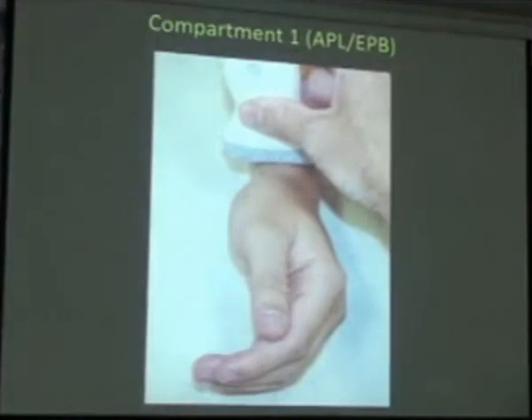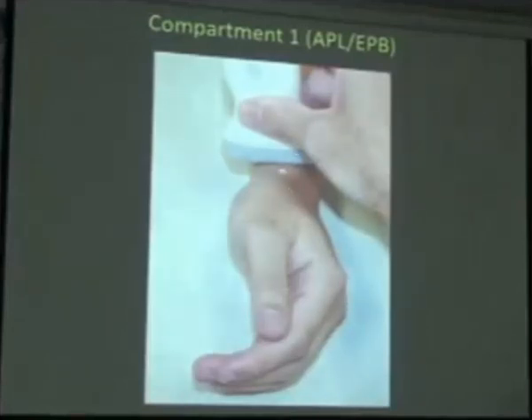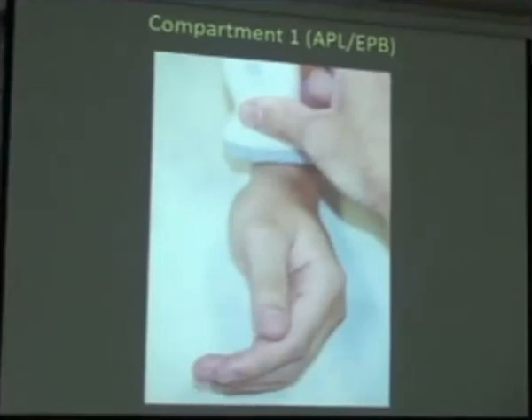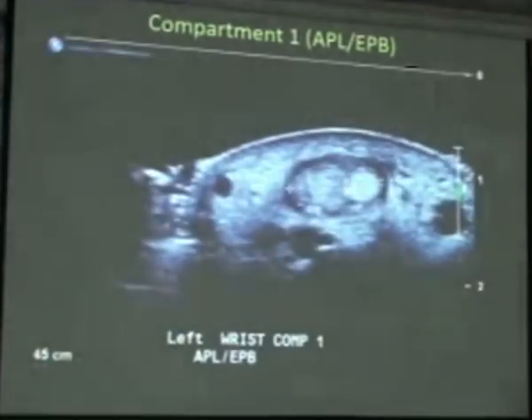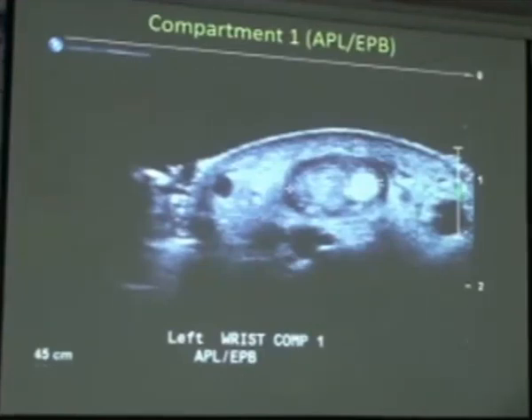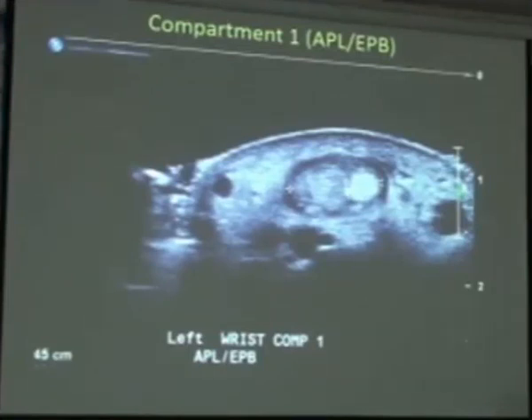The procedure to image this is quite simple. I sit the patient on a chair beside the bed with their arm resting on the bed. I do not use any standoff media — I just place the probe directly onto the wrist. The APL is the larger of the two tendons, and the EPB is right next door. It may look like a single sheath, but there's often a little separation that you don't appreciate until you start the injection.